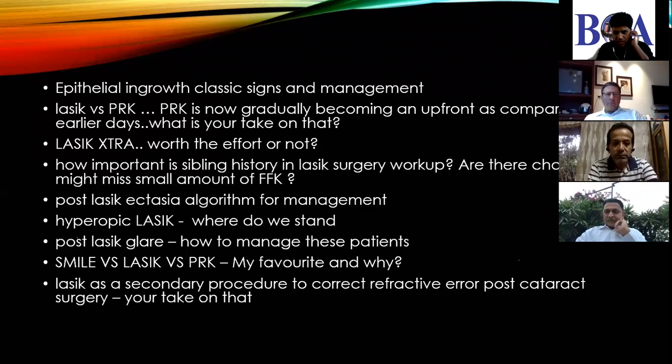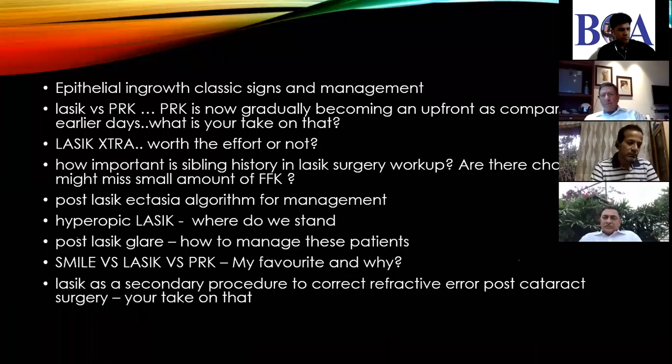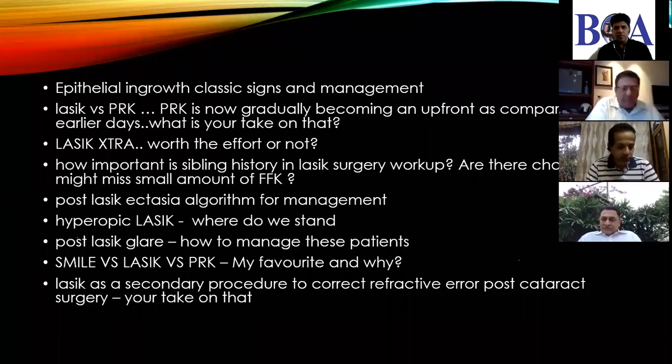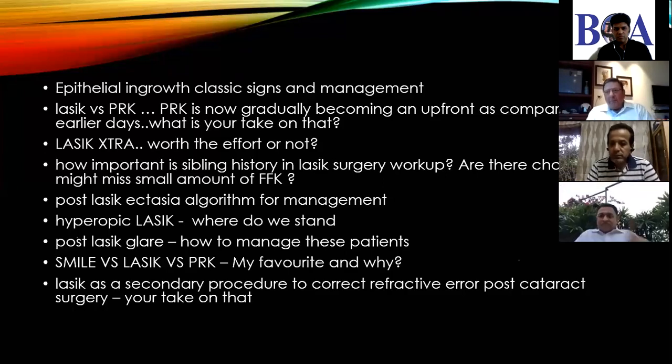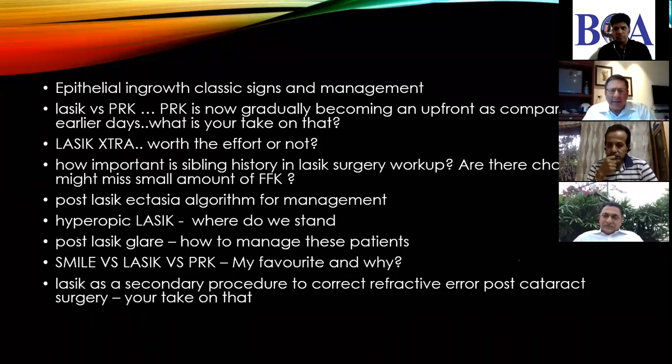Yeah. Okay. So, a few tips about hyperopic LASIK, patient selection and how to go about it. Yeah, so with hyperopic LASIK, the main thing has always been the regression and the lower amount of correction. It's not like myopia, where you do it up to -8, 10 and all. So these are the two main things. On these two things, what are the opinions? Bhaja? Increasingly I'm doing less and less hypermetropic LASIKs.